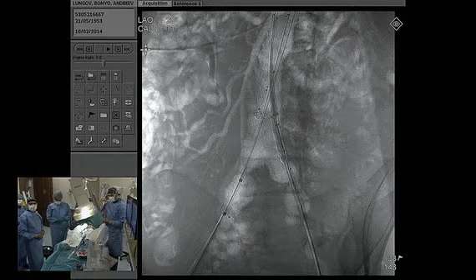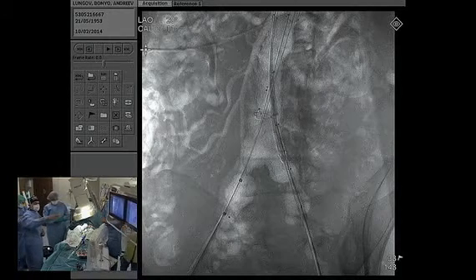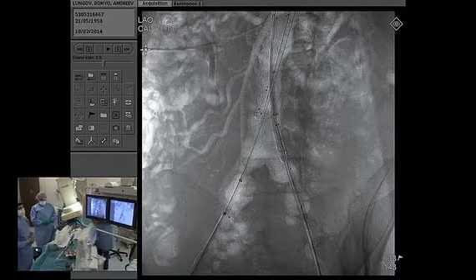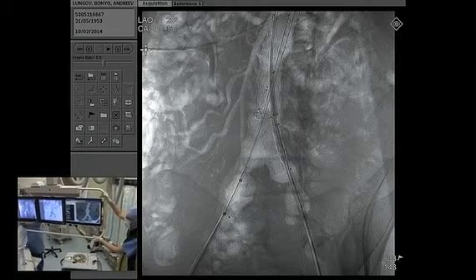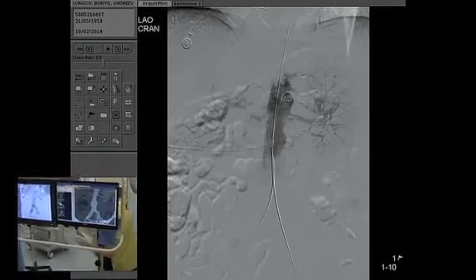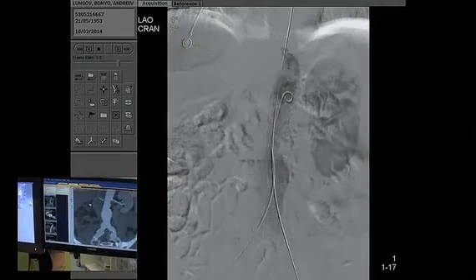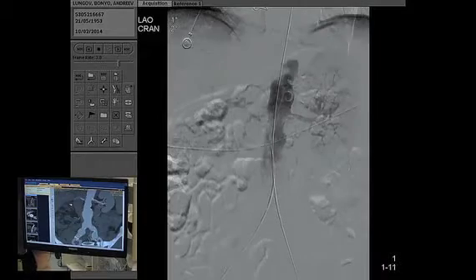Surely, that'd be fine. Okay, I would like to ask my assistant to turn the screen and the camera to show the CT on the right. The right panel is showing the case of abdominal and iliac aneurysm, with very tortuous iliac arteries.